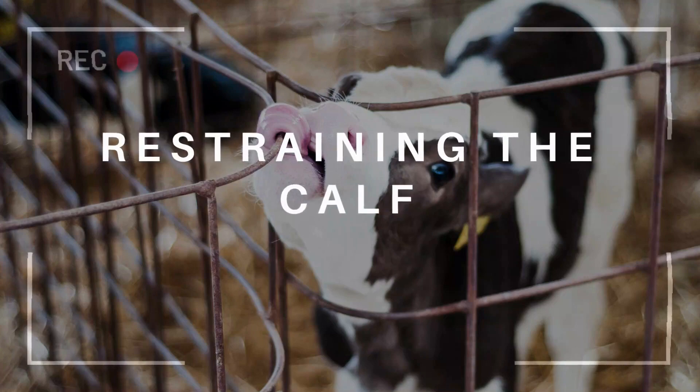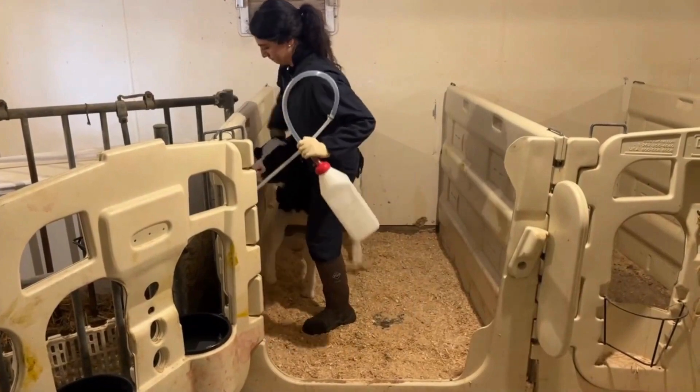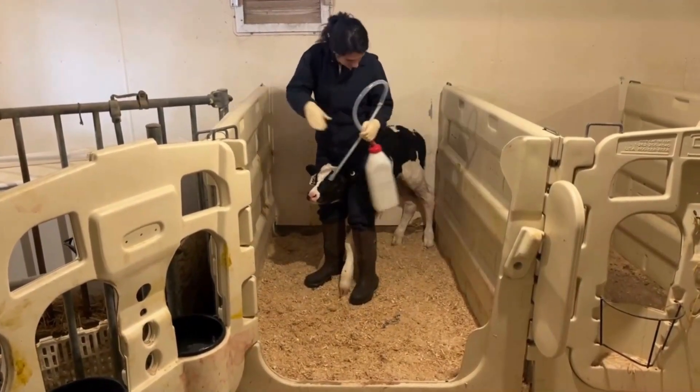We start the process by restraining the calf. This can be done by positioning a standing calf between your legs and backing the calf into a corner.